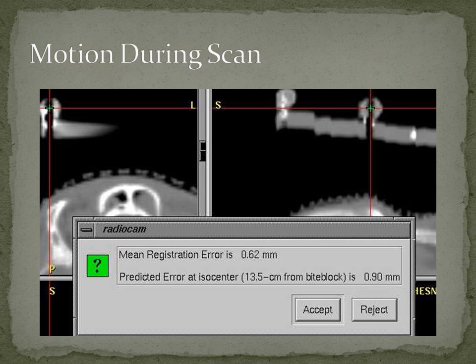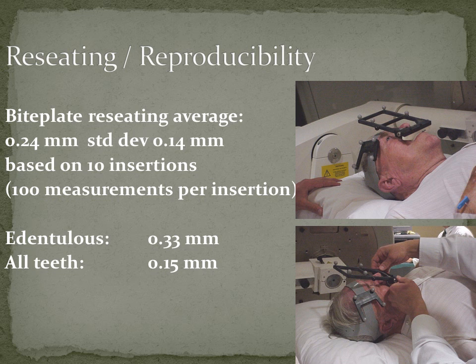We also have a secondary reference system, which is you're going to get down and you're going to use the operating microscope. The precision doesn't need to be quite as high as radiosurgery. But these type of errors, I think, do creep in on our day-to-day work, and I think we need to be cognizant that they could be there.